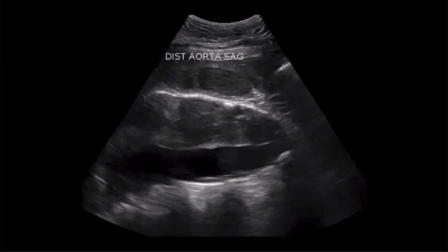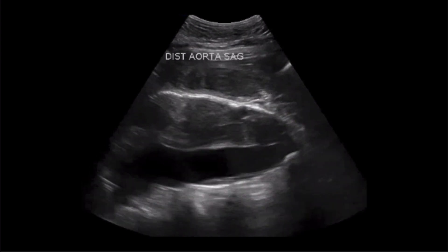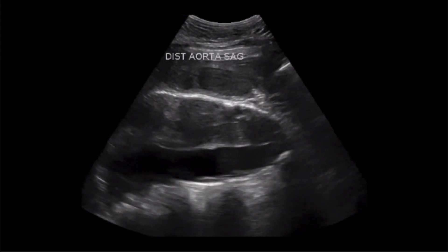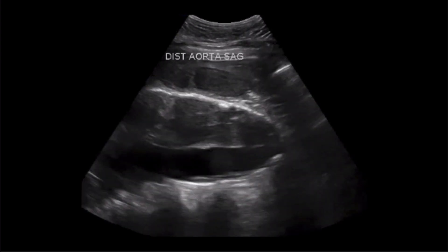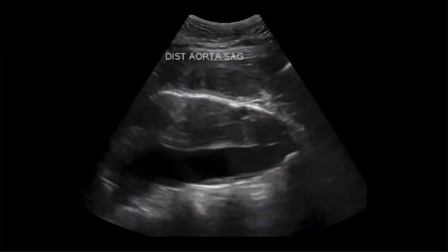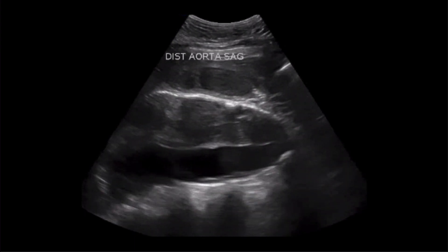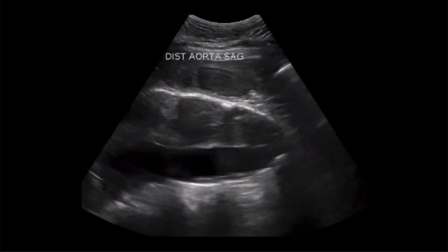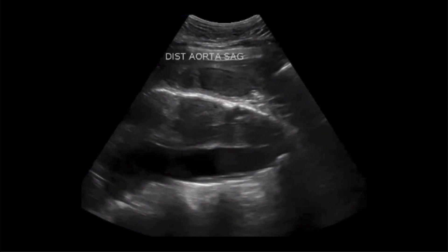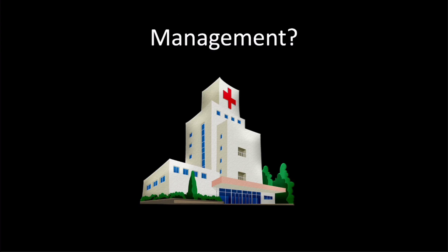The appearance of the aorta represents an abdominal aortic aneurysm with a large amount of echogenic clot within the aneurysmal component. Additionally, Dr. Henderson was able to identify free fluid when including other components of a RUSH examination. Details of performing a RUSH examination were discussed in the June 2021 video.